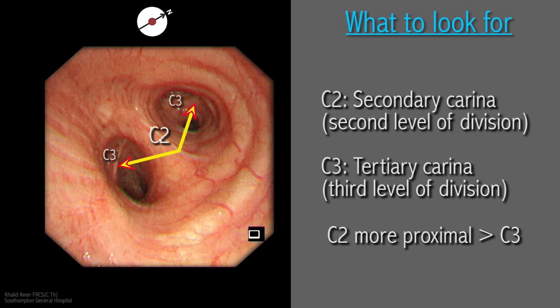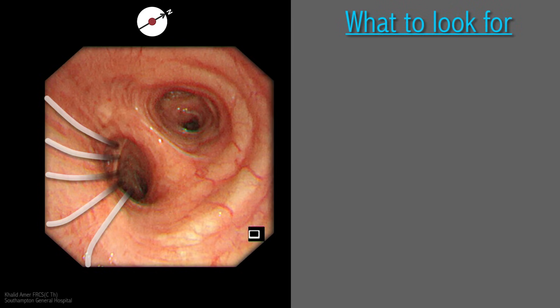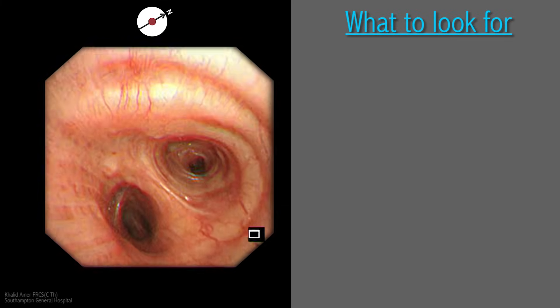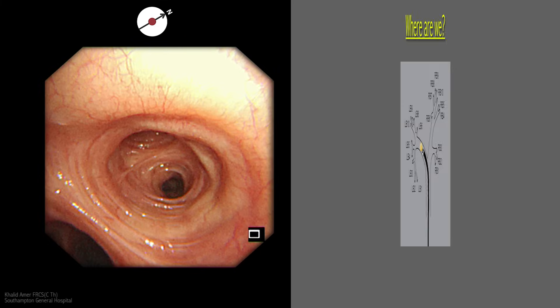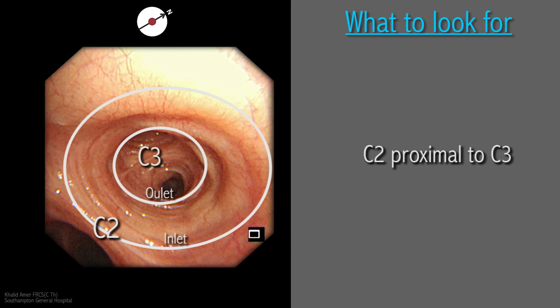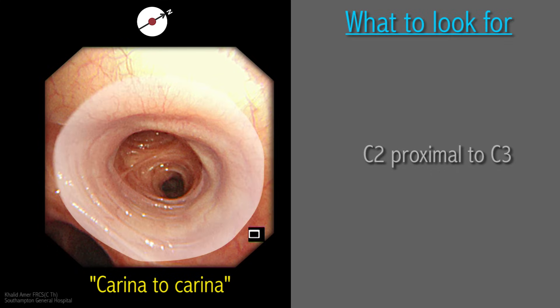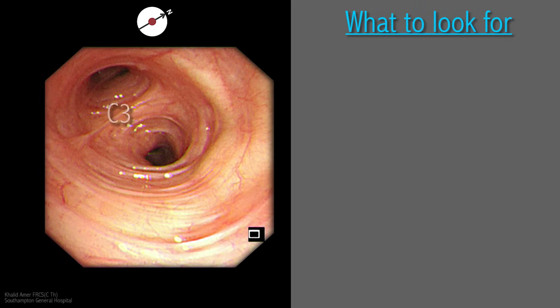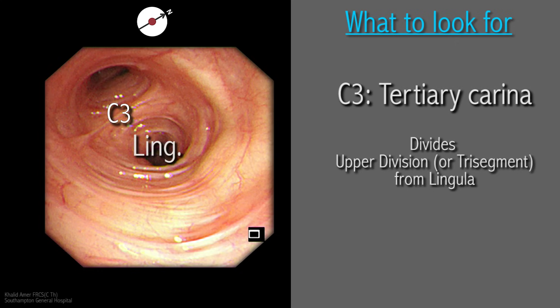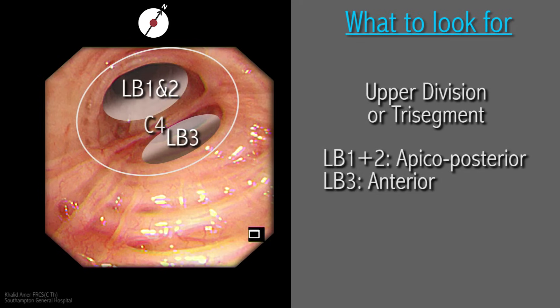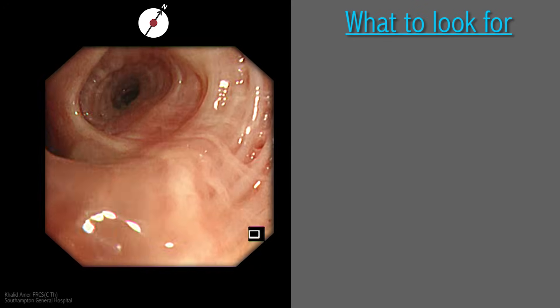On introducing the scope further down the left main bronchus, we first make note of the sharp secondary carina C2 between the left upper and lower lobe orifices, and also note the more distal origin of the tertiary carinae which divide the segmental bronchi. The membranous part, as always, will lead us into the lower lobe orifice — an important sign that I find very helpful when confused about orientation. On advancing the scope into the upper lobe bronchus, note is made of the carinae to define inlet and outlet. On approaching the upper lobe divisions, it's important to identify the tertiary carina C3 between the upper divisions and the lingula. The scope is advanced into the upper division, looking for the quaternary carina which divides the apico-posterior segmental bronchi LB1 and LB2, and the anterior segmental bronchus LB3.